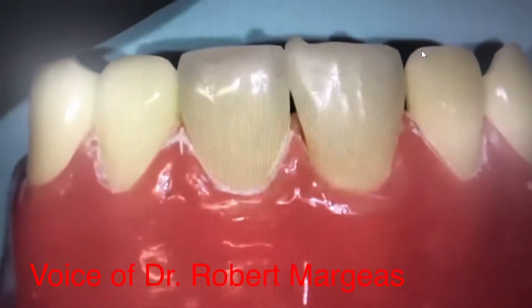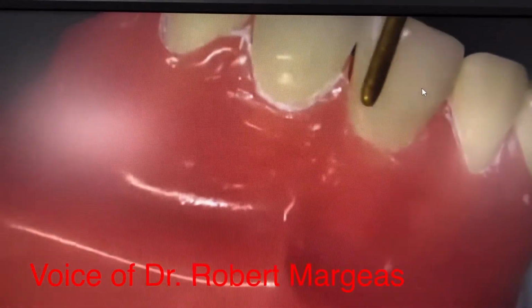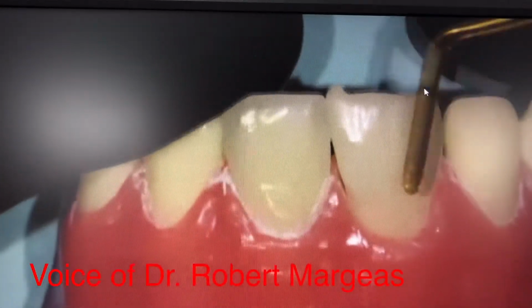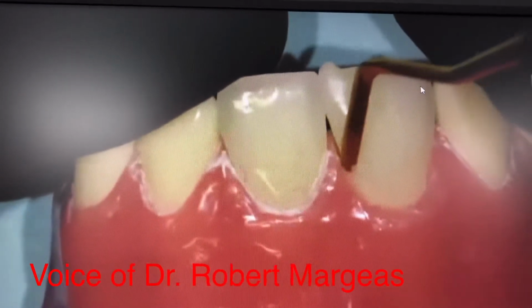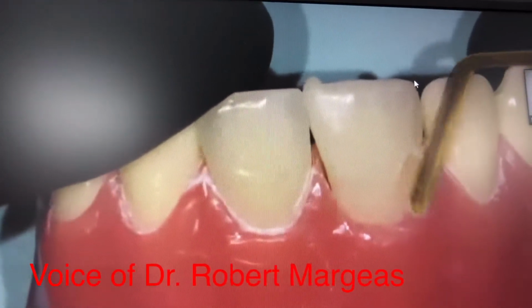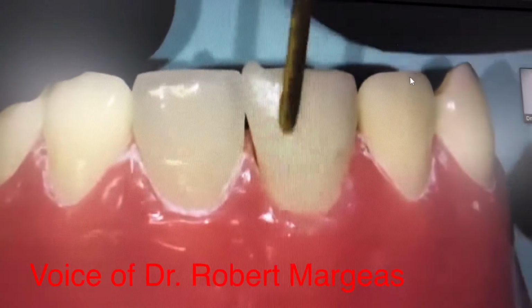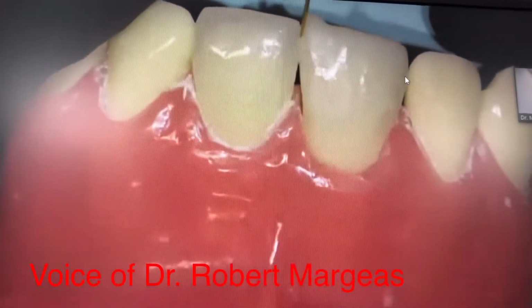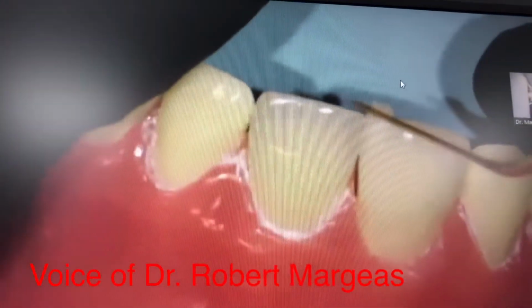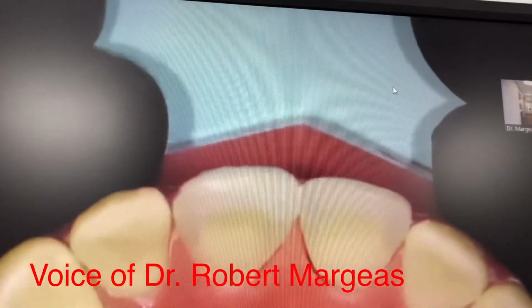Now I have some finishing to do, adapting this to the tooth a little bit better, but I'm going to have a very, very good contact with this. So I go ahead. I smudge the material where I want it. And then what I do is I will kind of cleave this off. And then I'll start using my brush. See, I have more room, I have more material than I need. You see how it's thicker? That's going to allow me to do finishing and polishing. I don't need quite that much.